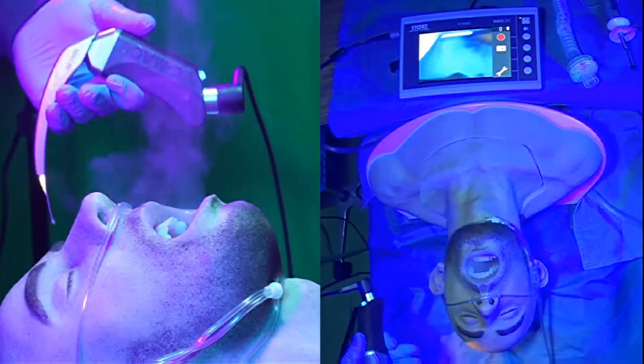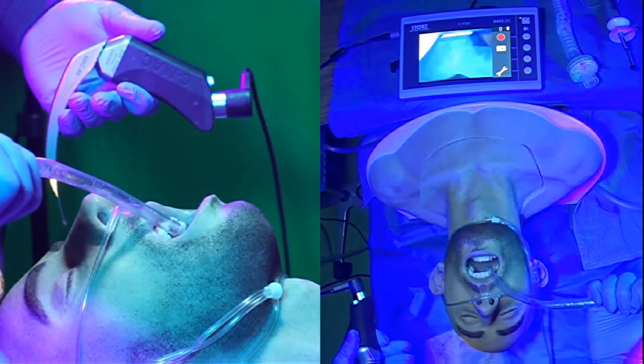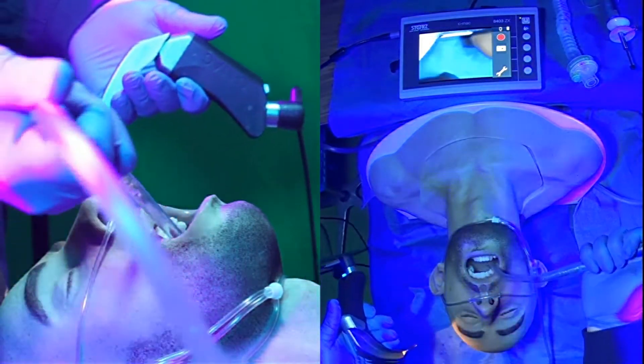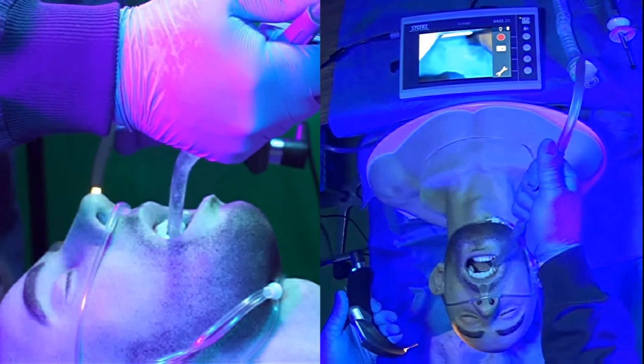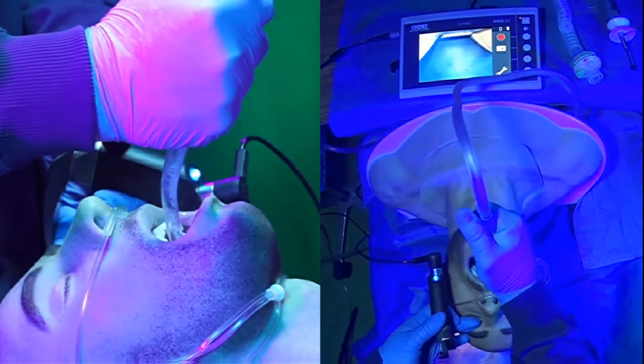To bring the catheter closer to the patient's mouth, you can see a dramatic decrease in the amount of vapors being released from the patient. As we advance that even further in the airway, simulating our suction techniques, it further controls that vaporized mist from forming and being discharged by the patient.